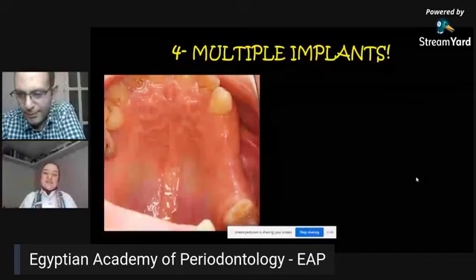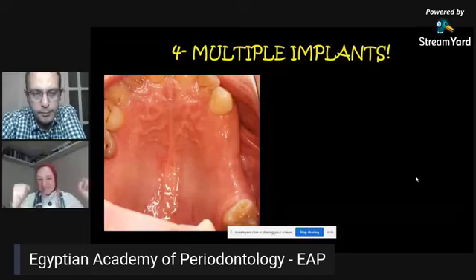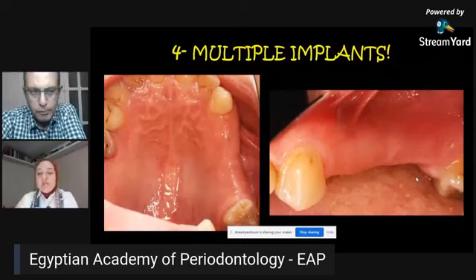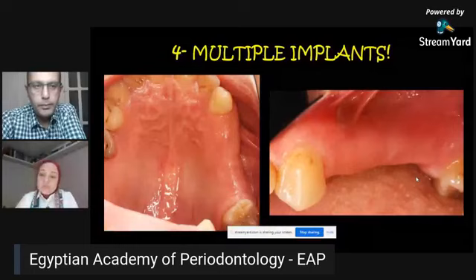Okay. The fourth case that we have here is a case of multiple implants, and especially with the fresh graduates that are so enthusiastic to work and put as many implants as they can, they think of this as a simple case. However, we all know that multiple neighboring implants, more than two or three teeth, is really a challenging thing to do, especially if you want to do it with a correct prosthetically driven position and with good parallelism and with everything going fine without the need for maybe angulated abutments or maybe impinging of the soft tissue or the bone in between and so on. So here we had a case with three missing neighboring teeth, 4, 5, 6.